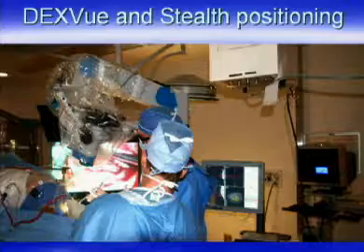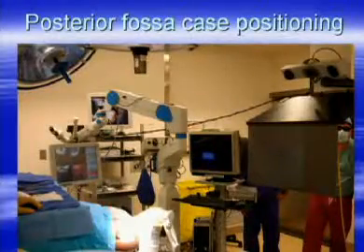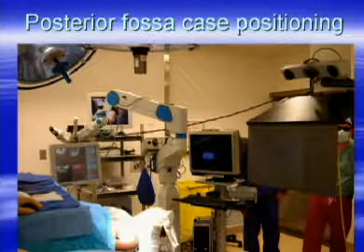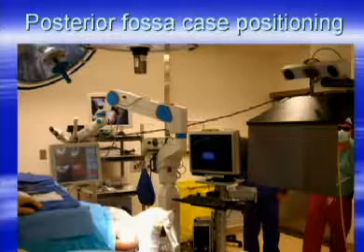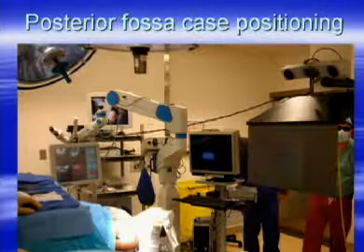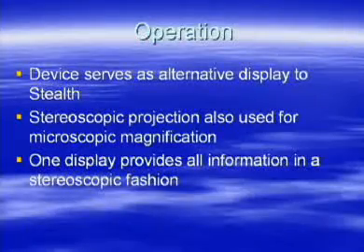The compelling aspect of this for our particular application was right down here is the Polestar, and we were able to place the projection system at the 10 Gauss line without any distortion of the resultant images. And so here is basically the lineup with DexView, Stealth Station, and the projection system. We did a second case with a posterior fossa. Here the change was a little bit different. Instead of having it alongside the body of the patient, we had the projection system above the patient's head with DexView and the Stealth Station in this location.